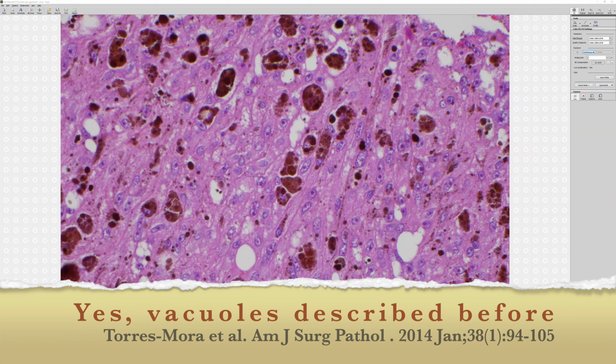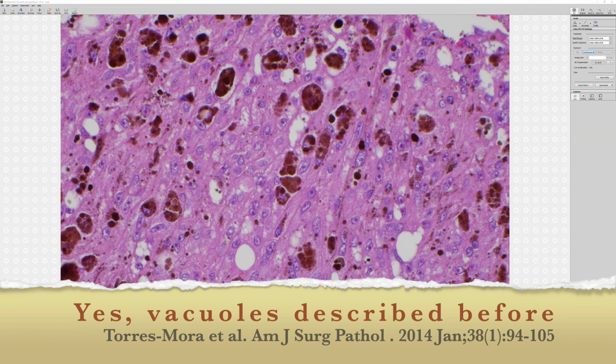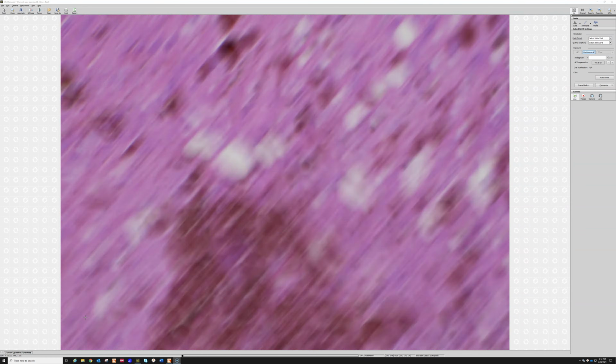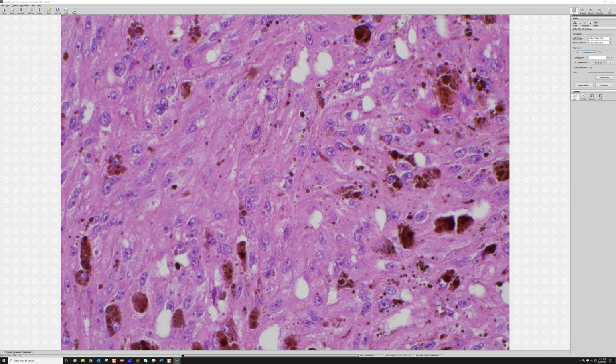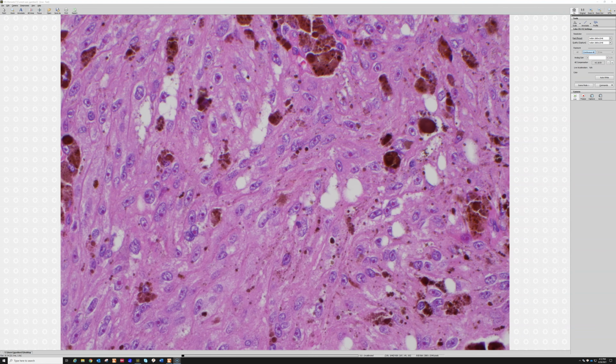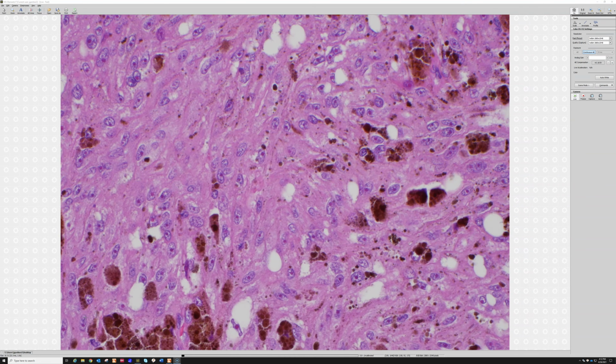I've only seen a small handful of these tumors, and each one has looked a little bit different, but they all keep in common the fact that they're producing melanin pigment and have these spindle to epithelioid cells. Some of them, like this one, look very ugly and have huge nucleoli and look quite a lot like melanoma, but I've seen other ones that were a little bit more bland and monotonous with uniform cellularity and were a bit more spindled and not as epithelioid as these. So they can really range between spindled cells in fascicles to more epithelioid cells in diffuse syncytial sheets where it looks like all the cytoplasm from each cell is blending together to make a sea of cytoplasm.